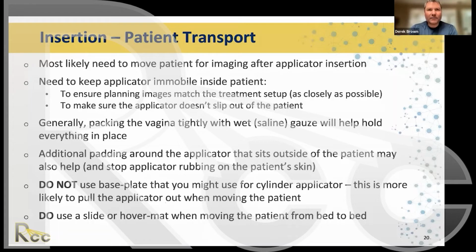The idea of full versus empty bladder, I think, is less definitive. Some radiation oncologists always want to treat with a full bladder, with the idea that the bladder pushes some of the sigmoid and some of the bowel out of the way. The bladder actually has a fairly high radiation tolerance, so they use that strategy for every single one of their patients. Some radiation oncologists think that is not necessary at all. My guess would be that it is dependent on patient anatomy.